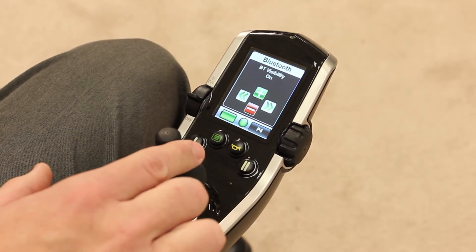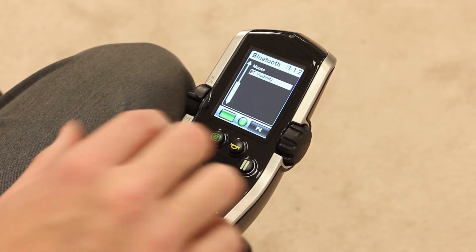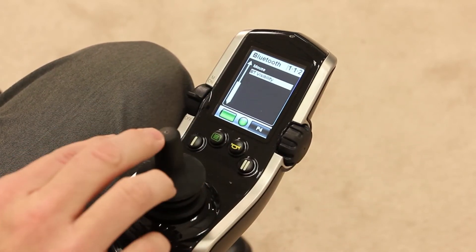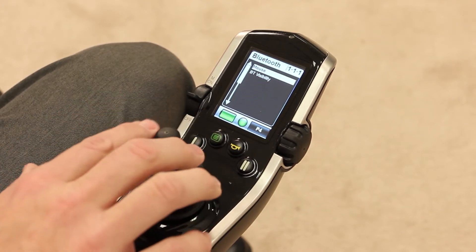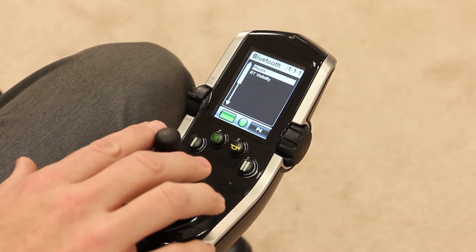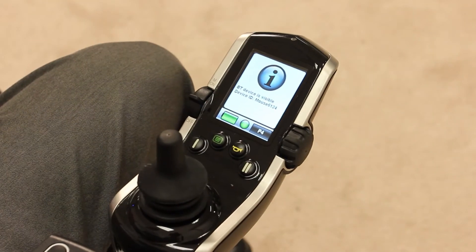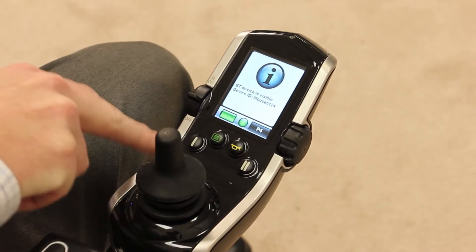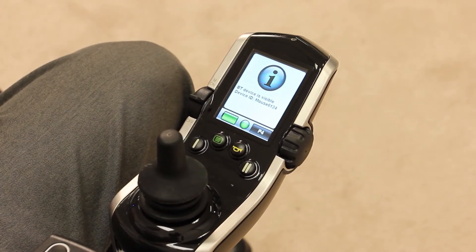We're then going to give a left command, which brings us back to this screen. We're going to give a forward command to highlight mouse and give a right joystick command to enter it. This screen is telling me that the Bluetooth unit in the hand control is looking for the device that it's going to sync up to.